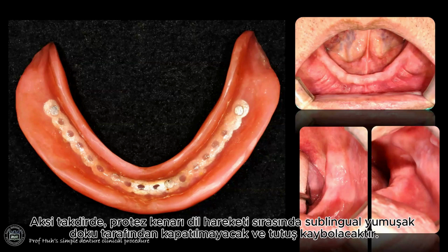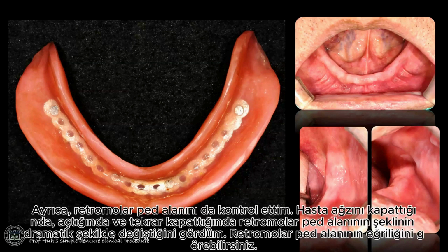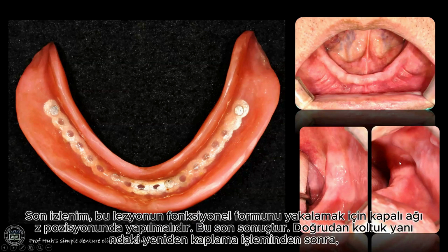Otherwise, the denture border will not be enclosed by sublingual soft tissue during tongue movement, and the retention will be lost. Also, I checked the retromolar pad area. The retromolar pad area changed its shape dramatically when the patient closed the mouth, opened the mouth, closed the mouth. You can see the curvature of the retromolar pad area. So the final impression must be made in the closed mouth position to capture the functional form of this area.